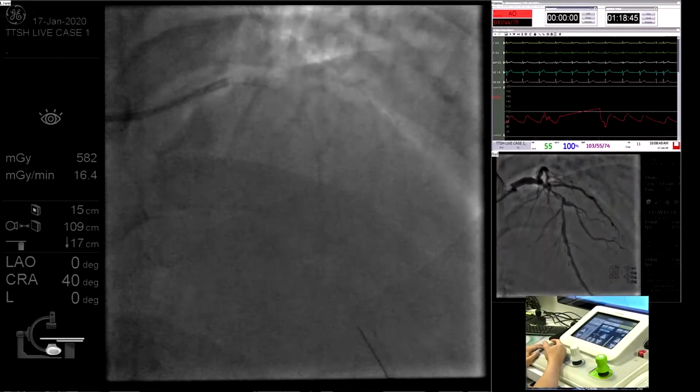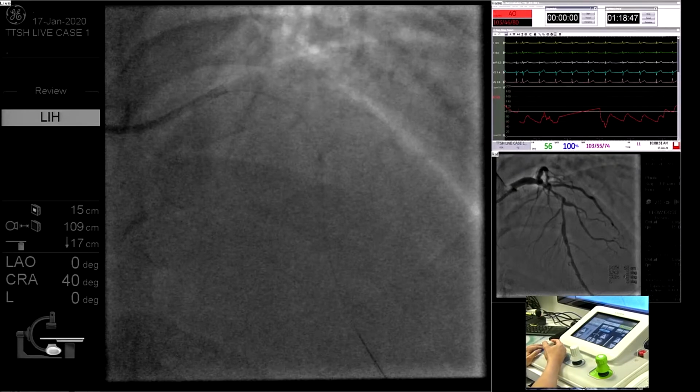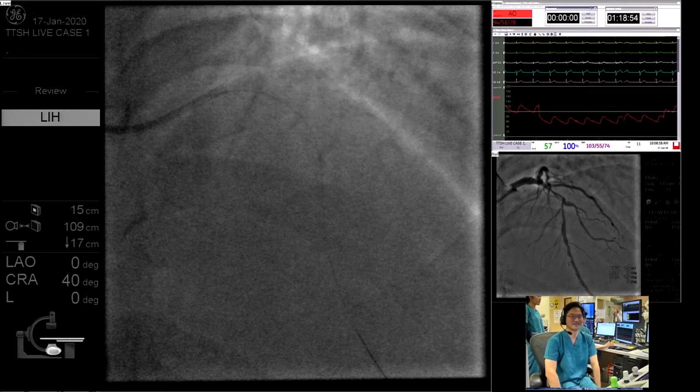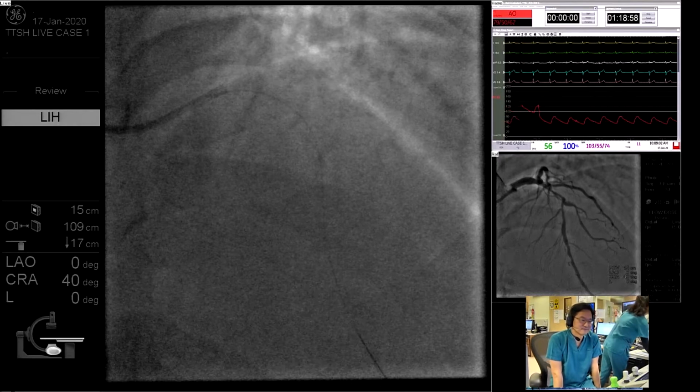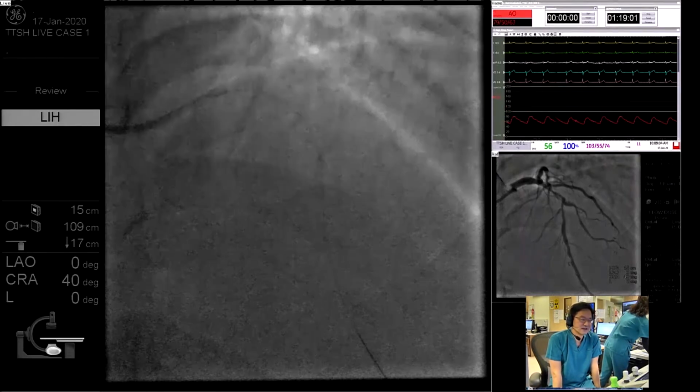Sorry, earlier on there was a question. I kind of ignored that. Can I have the question back? Sure. This is Nimit. What were you asking about? Yes. So if you were in the lab, do you think you would have been able to track the stent manually without using this pre-dilatation?